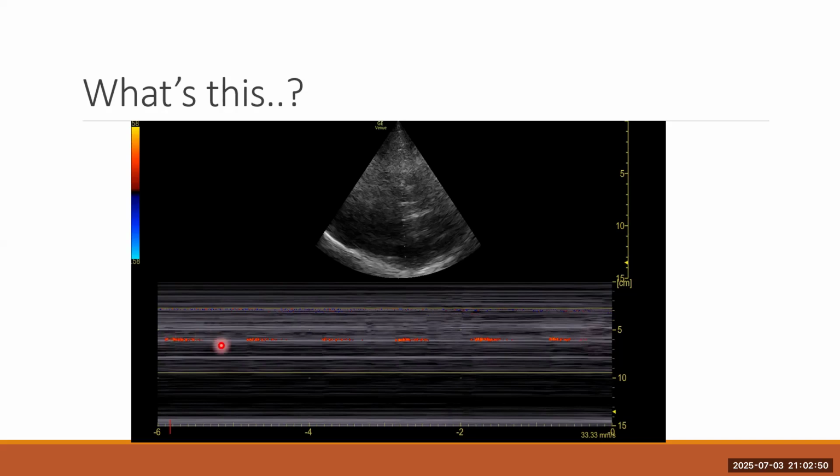We can see a lot of pulsatility. So this patient had a very high pulsatility index. We can just see the reds coming up. He was just on the verge of being brain dead. So we can see there is significant absence of the color flow, possibly in the diastole. This is just converting an imaging Doppler into a non-imaging Doppler by putting an M-mode.